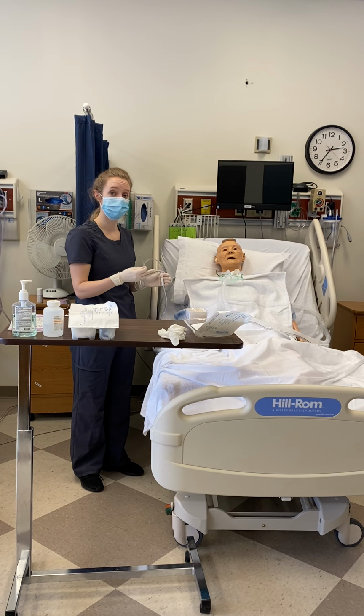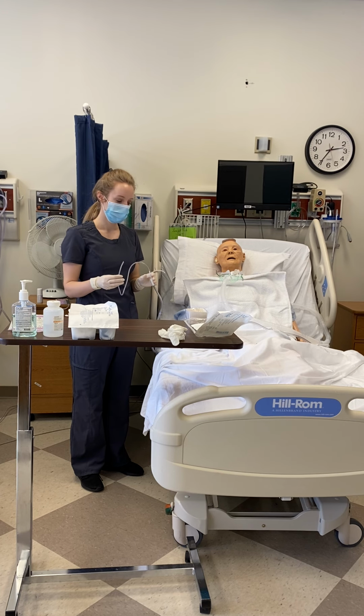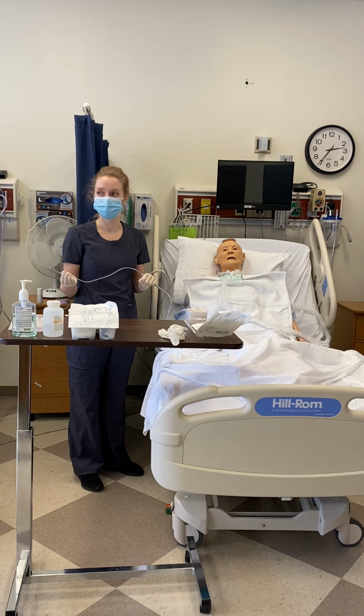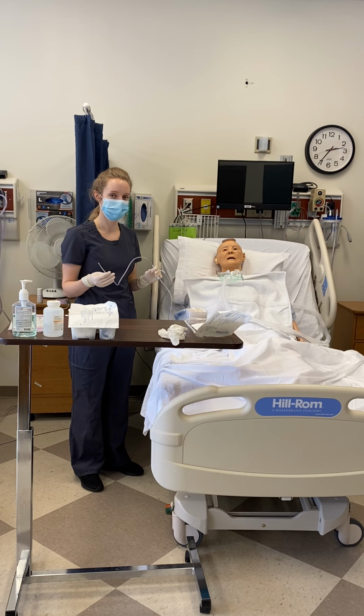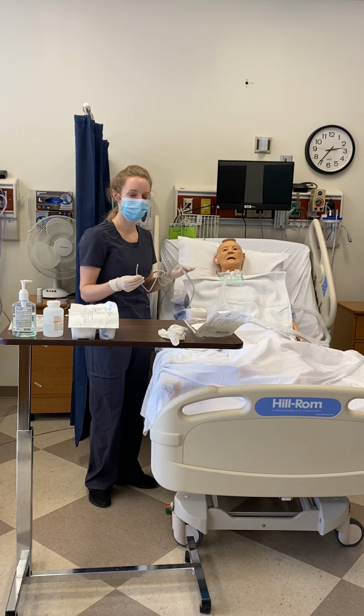That could be visible secretions, gurgling or adventitious breath sounds, increased pulse rate, increased respiration rate or pattern, decreased oxygen saturation, decreased consciousness, or cyanosis anywhere in the body. All would be good reasons to suction Mr. Smith today. And I've removed the oxygen.